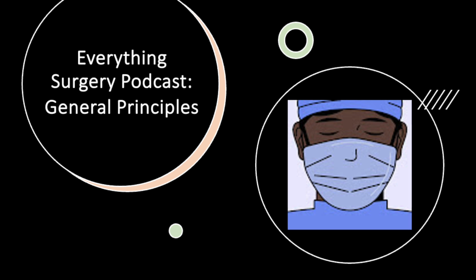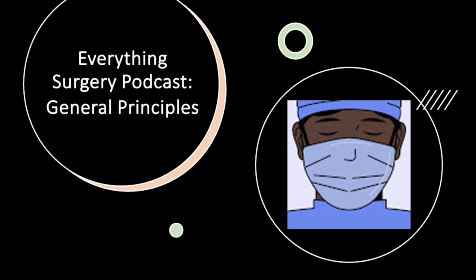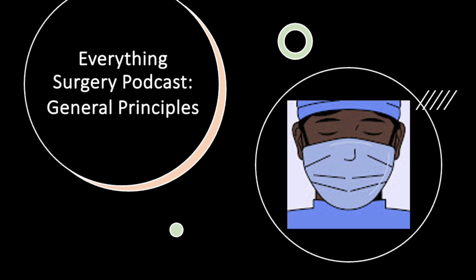Putting it all together, pattern recognition. Experienced interpreters rapidly scan for critical, life-threatening patterns. These include ST elevation myocardial infarction, which is identified by ST elevation in contiguous leads, life-threatening arrhythmias such as ventricular tachycardia, ventricular fibrillation, complete heart block, and rapid atrial fibrillation. Toxic or metabolic conditions like hyperkalemia, which presents with peaked T waves and wide QRS complexes, or prolonged QT intervals.